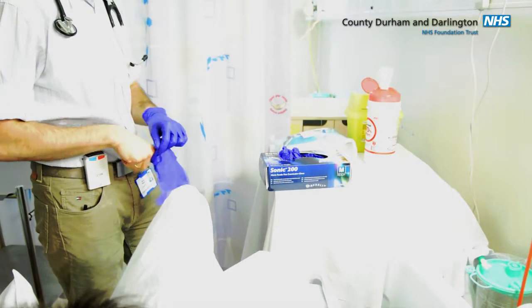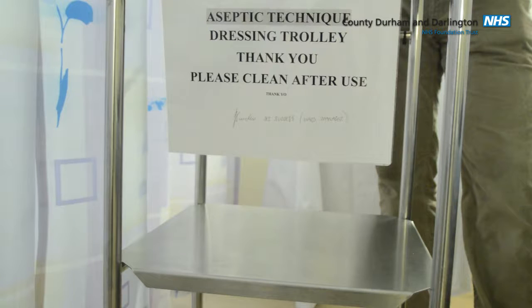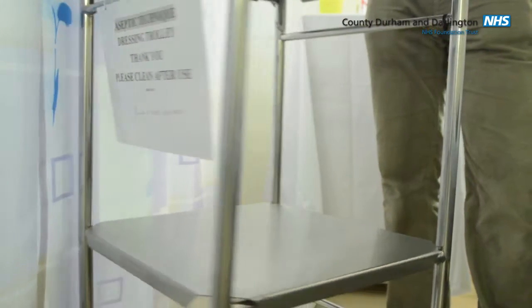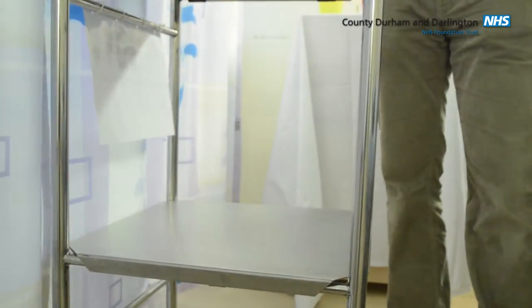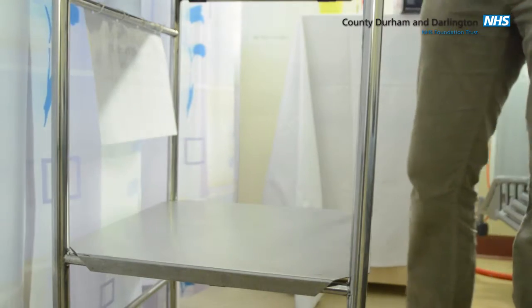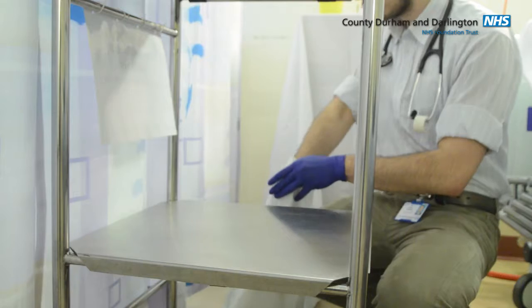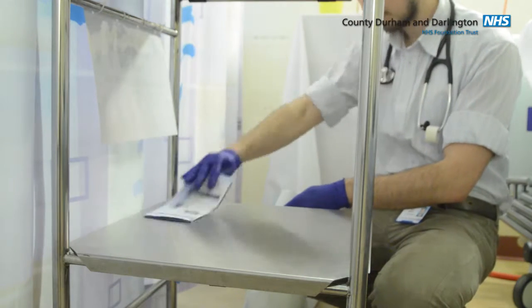Gather up all the necessary equipment. If you can't find any blood culture packs in your clinical department, they are available from the pathology reception. If you're working in paediatrics, a separate blood culture pack is available, and this has a single bottle. Take out the equipment from the pack and place onto the bottom trolley.